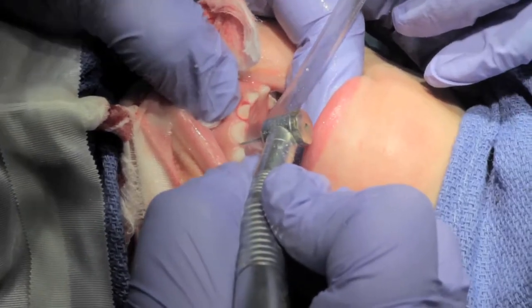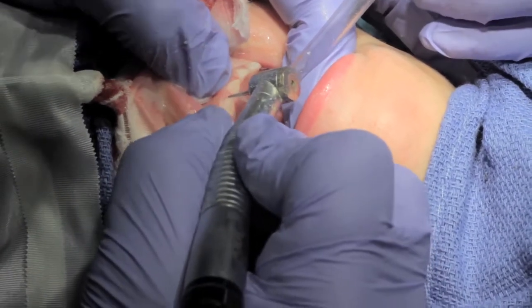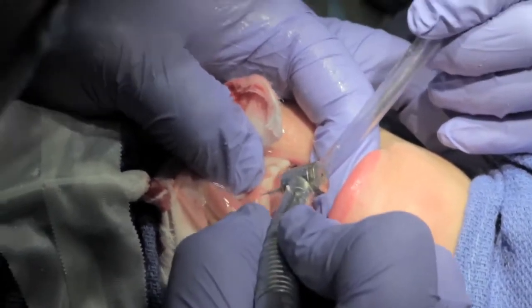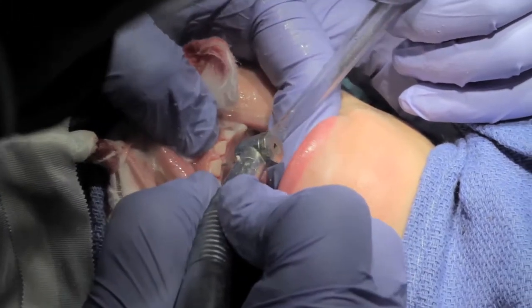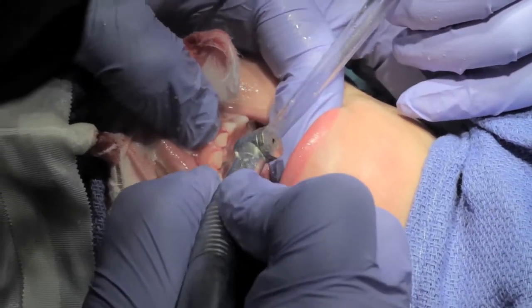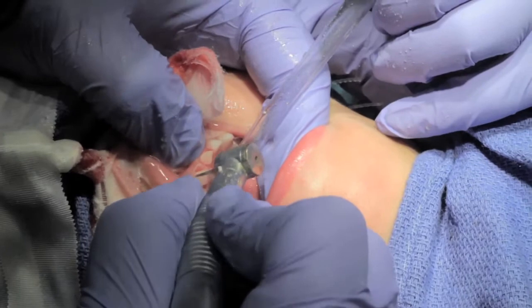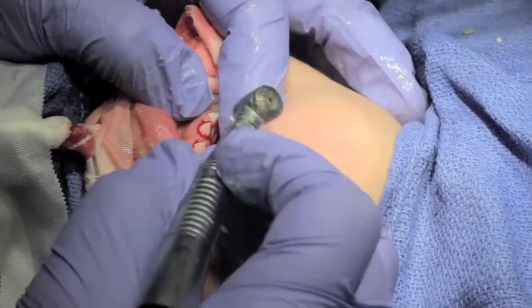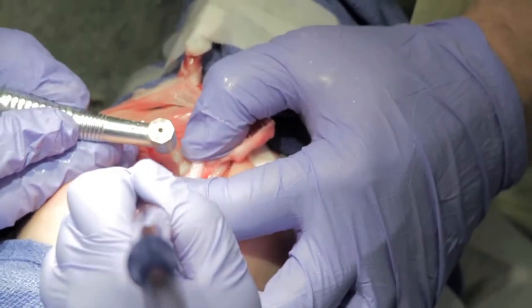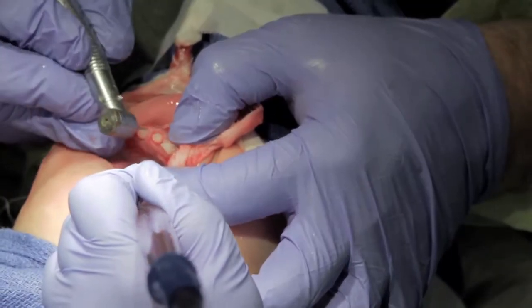Reduce the facial, break contact mesial, wrap around the facial, break contact again. Then wrap around the lingual a little and just round everything off. You want everything rounded. The whole prep is subgingival. You want to make sure you take enough off the palatal so that the crowns fit — sometimes I'll go back and take a little extra off just to make sure.